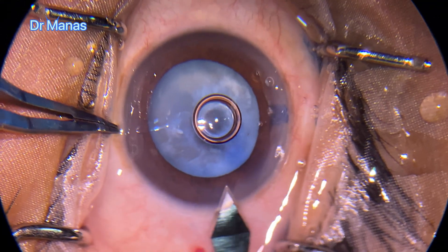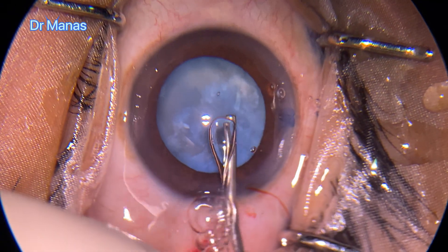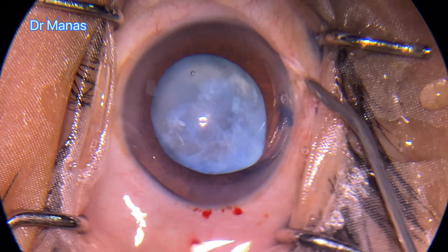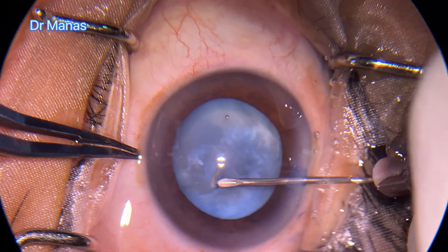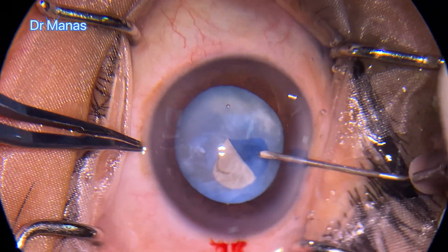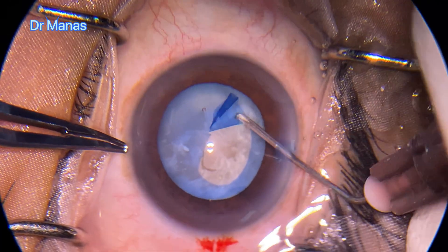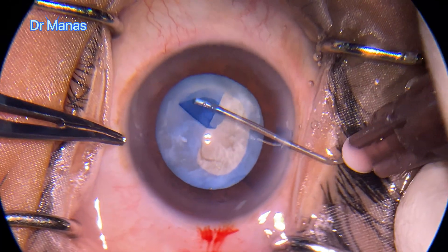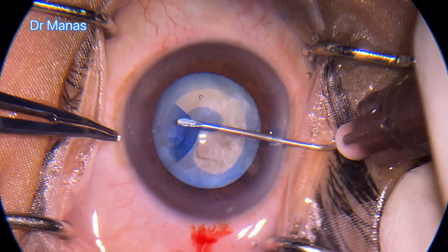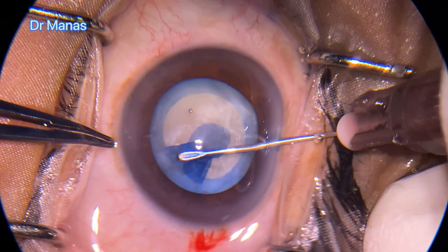After making the side ports and entering with the main tunnel, I'll be starting my capsulorhexis with a cystitome. There is no fluid pocket inside. The plan is to do a capsulorhexis of around 4.7 to 5 millimeters at least.